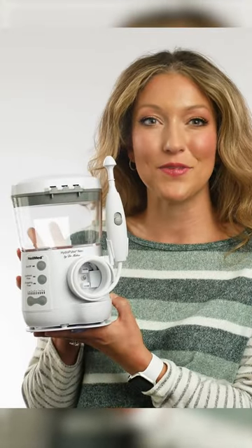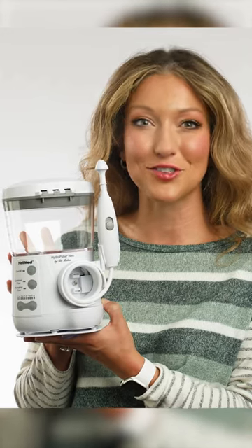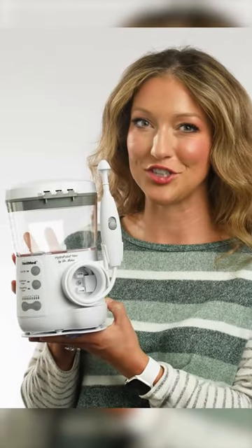The NeilMed HydroPulse Neo is a multi-speed pulsating nasal wash designed to provide all-natural sinus relief. With three different pressure settings, you can quickly alleviate allergies or congestion.